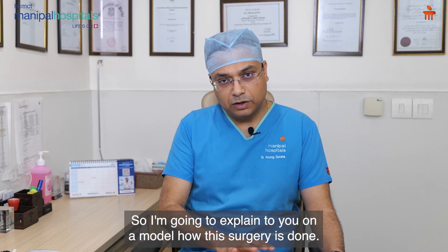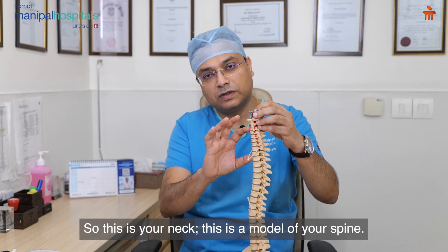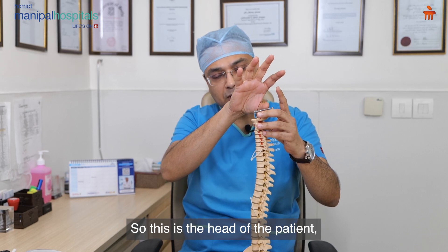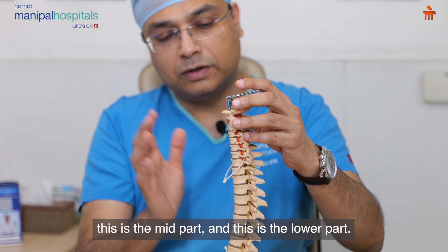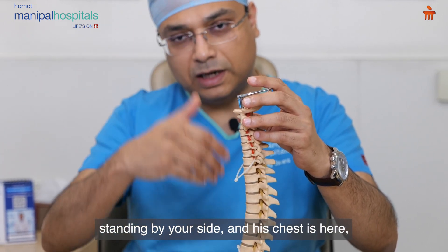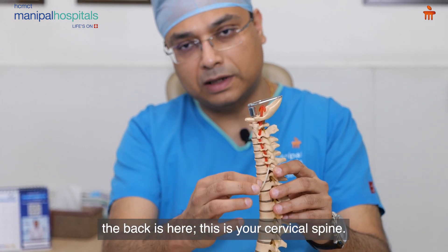I am going to explain on a model how this surgery is done. So this is your neck — this is a model of your spine. This is the head of the patient, this is the neck, this is the mid part, and this is the lower part. You can imagine the patient standing by your side — his chest is here and the back is here. This is your cervical spine.